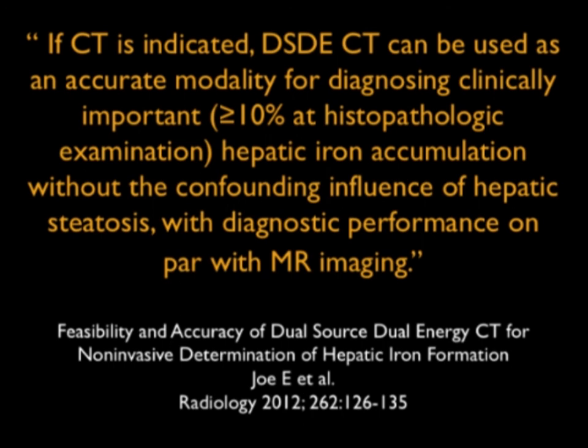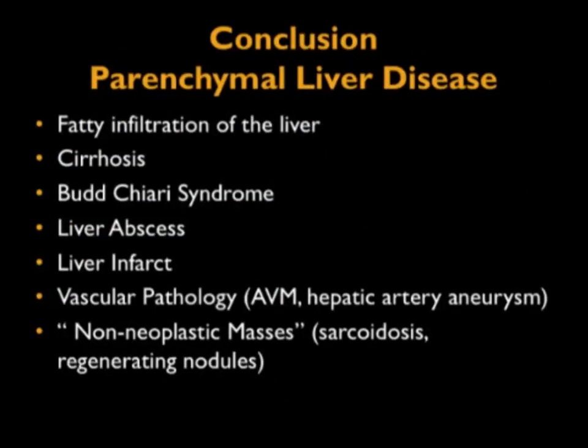In fact, dual energy, the liver has great potential. We've not really used that potential, but I think it's something that you will see coming along. Concluding then, I've looked at a number of things that you can fit in the parenchymal liver disease, or you can fit in the non-malignant category. We spoke about some of the pitfalls, some of the important things to remember. We looked at a range of things from Budd-Chiari to abscess to infarct to fatty infiltration, and hopefully you've picked up some good pointers. And if you have any questions, please let me know.